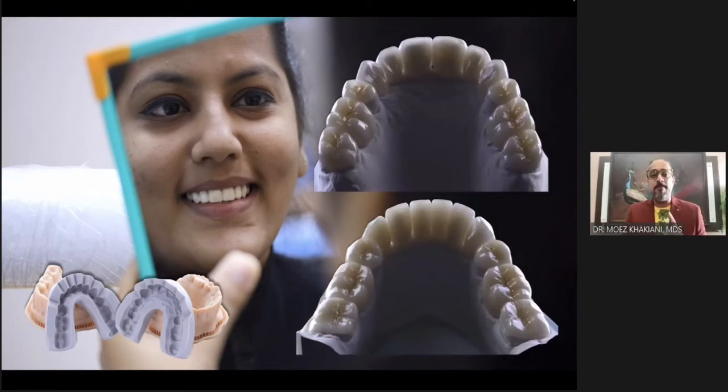But then very, very important, when you give them something that appeals to them, make sure your final is an exact copy. And this is where the digital technology steps in, because when you mill your restorations, your final work is an exact replica. It's a duplicate of your test drive or of your temporaries. So there is no, अरे मेरे को तो ये अच्छा लगा, मेरे को तो वो अच्छा लगा. Whatever corrections are needed, do it within the provisional phase and then make sure the final is an exact copy. And that is only and only possible with the help of digital copy paste technology.